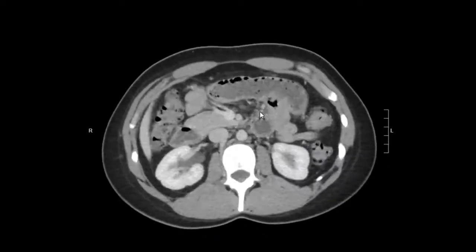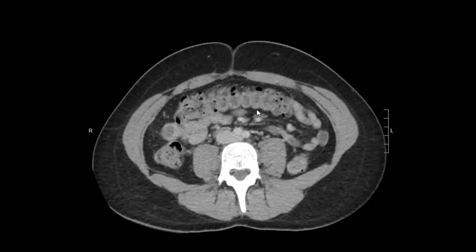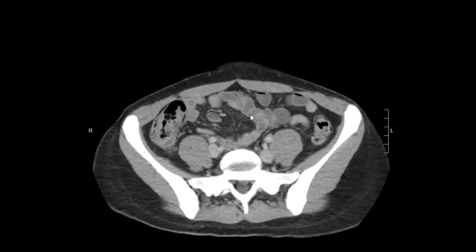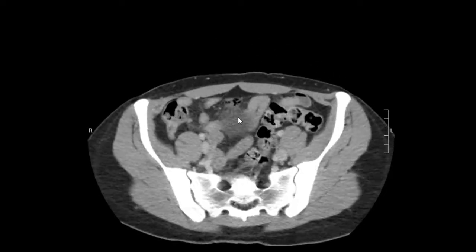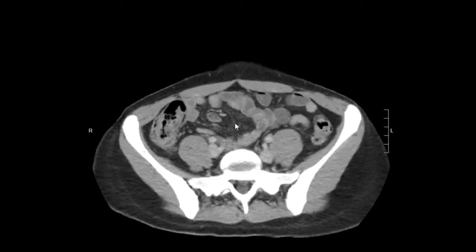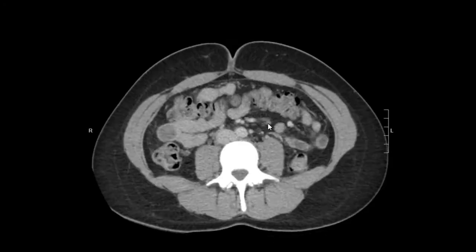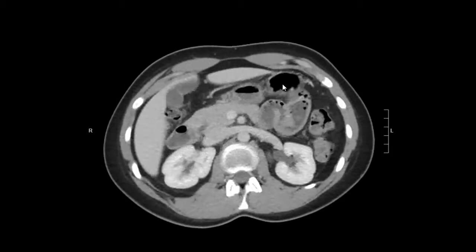There's normal mesenteric vascularity, there's no congestion, and there are no inflammatory changes of the mesenteric fat. The fat should look — if we look at more subcutaneous fat over here — this is a normal density of fat, with some vessels coursing through the mesenteric fat. So all of that looks pretty normal.